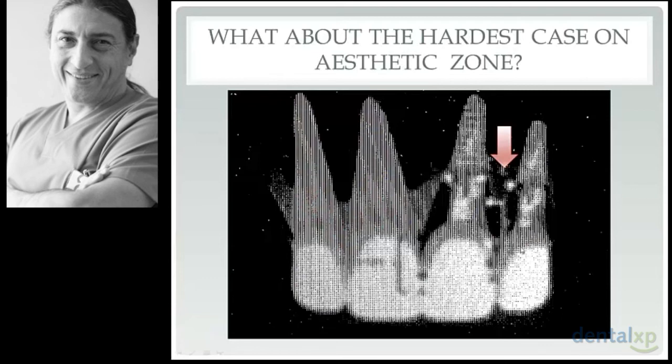But what about the hardest case in the aesthetic zone? That means two implants side by side. What can we do here? Because of the length of the papilla compared to the contralateral side.